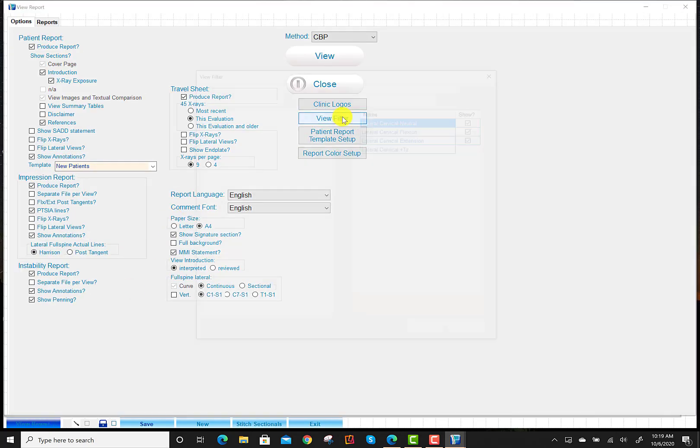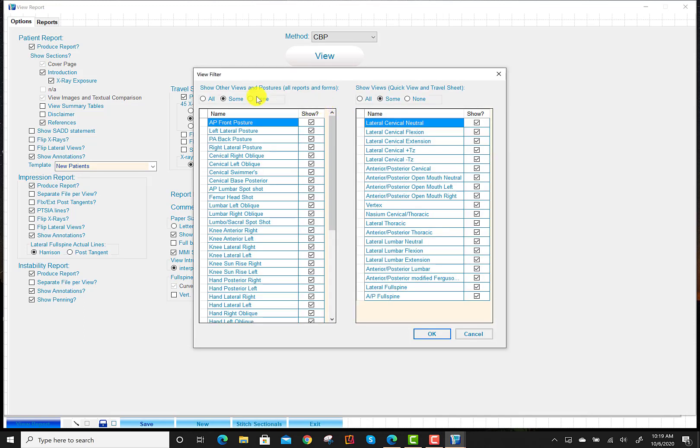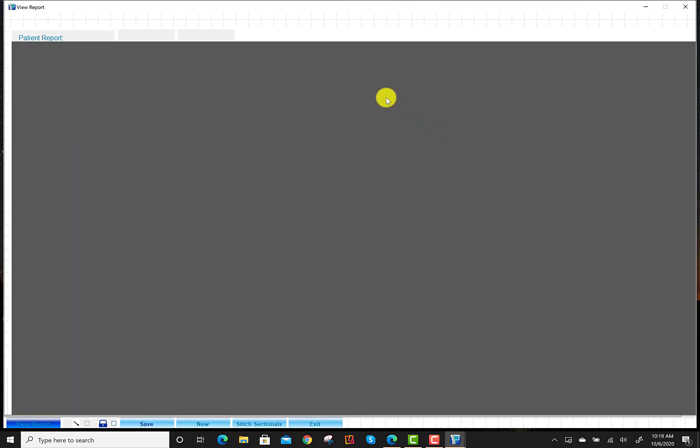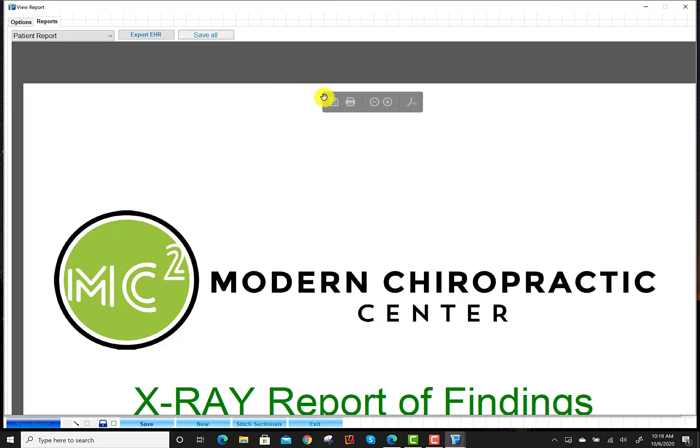The view filter allows us to pull up any and all additional x-rays. So I'm going to go ahead and select all on both of these, so that it lists everything that's available. With that being said, if I generate a report just to show you where these are at, let me go ahead and show that.